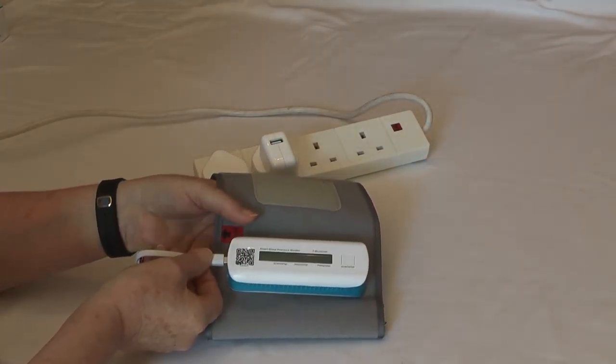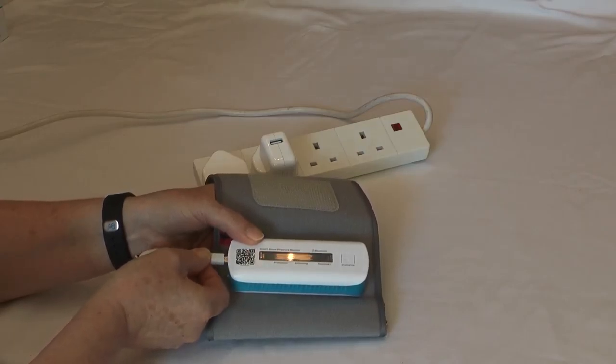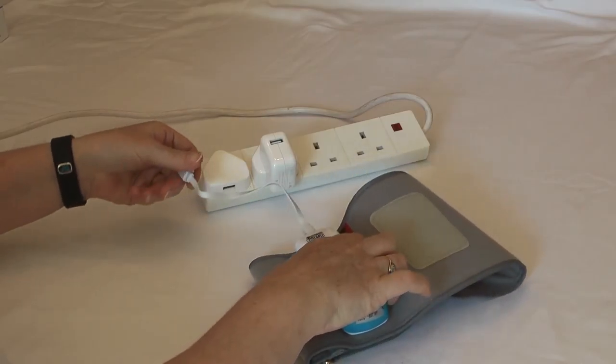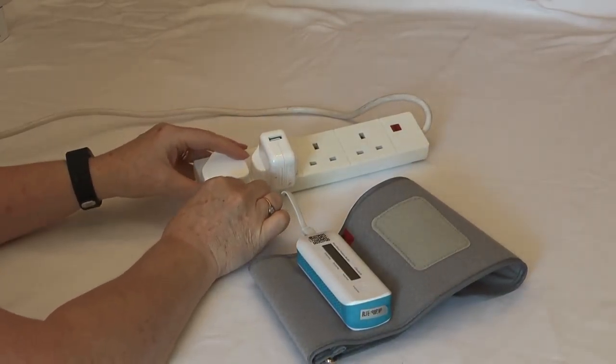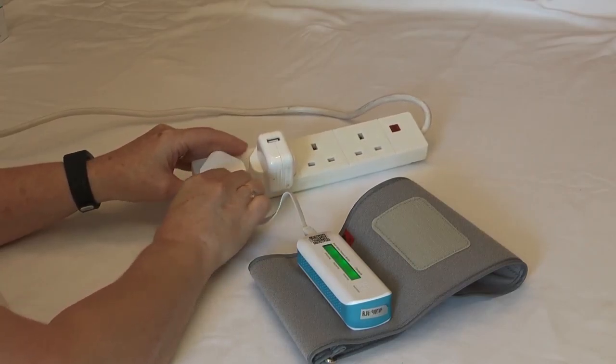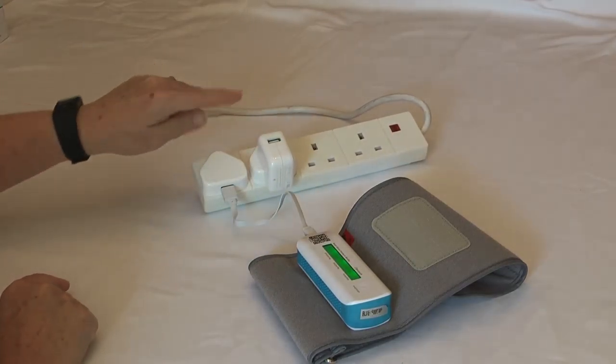To charge it, it needs an initial two-hour charge. Placing it in the charging point and then using a plug that is less than one amp, leave it for two hours. The screen will light up. Don't use a plug that is over one amp.